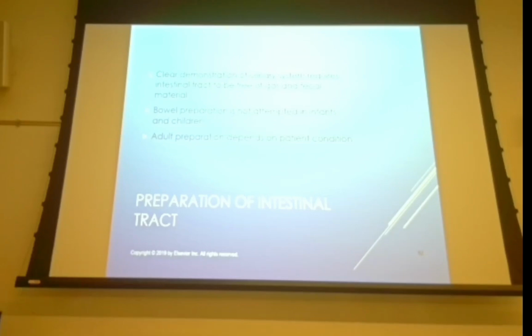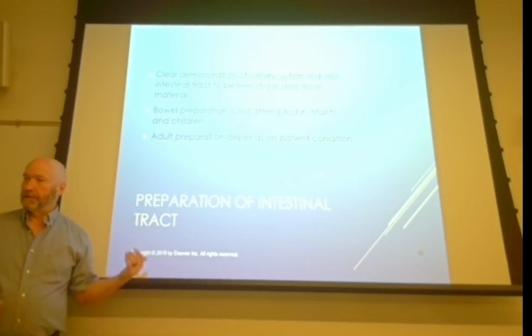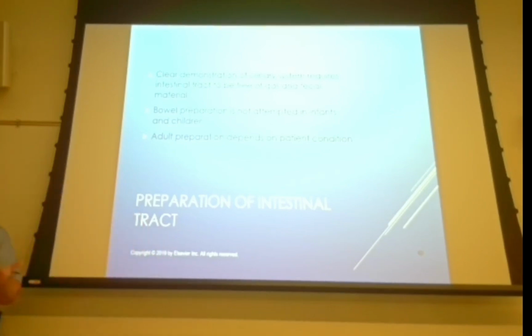All right, so preparation, it depends. If we have a patient that comes to the ER, which really a lot of our kidney stone patients are gonna come from the ER, there's not a whole lot you can do, right? But if it's a scheduled exam, then we're gonna do something kind of like an upper GI. We're gonna do a low residual diet, maybe an enema, maybe laxatives, things like that. But at the very minimum, NPO after midnight. Scheduling, again, the patients that are potentially diabetic, first thing in the morning, try to get them out of the way so that their sugar doesn't give them a hard time.